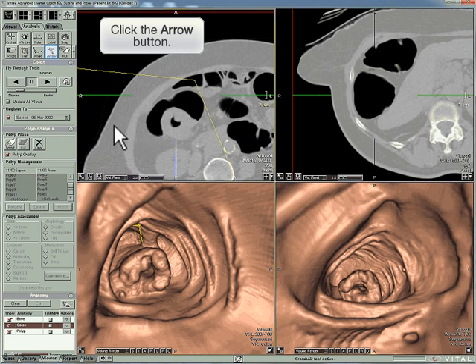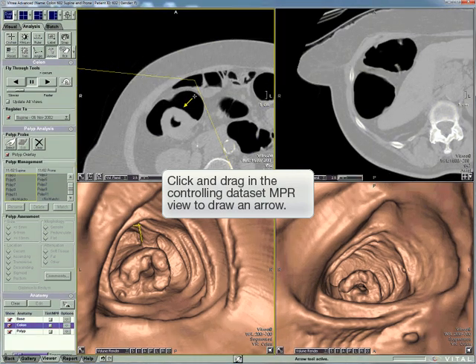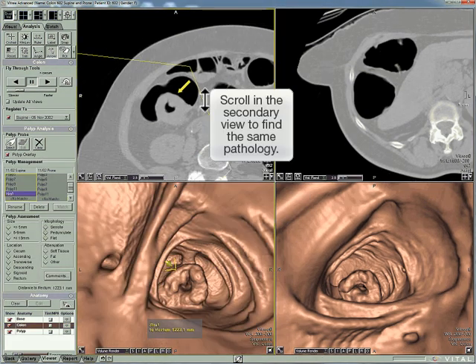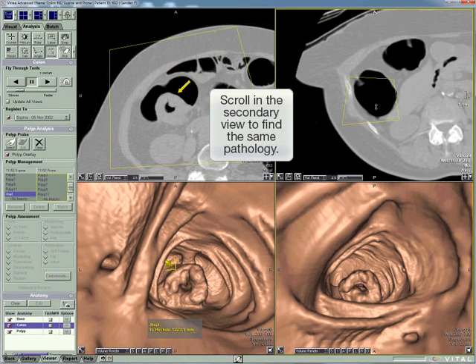Click arrow, or right-click and select arrow. In the controlling data set, click and drag to draw an arrow. Scroll in the secondary view to find the same pathology.